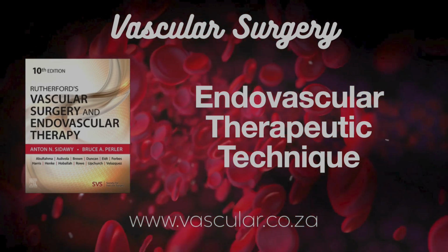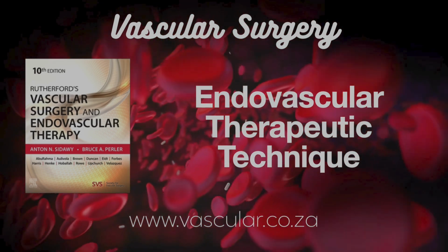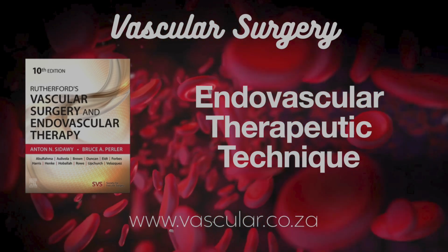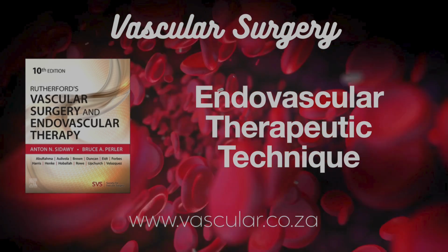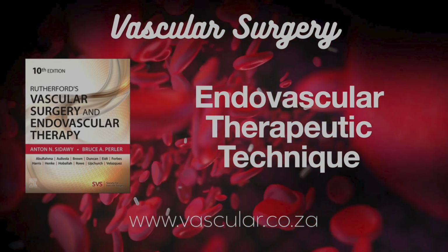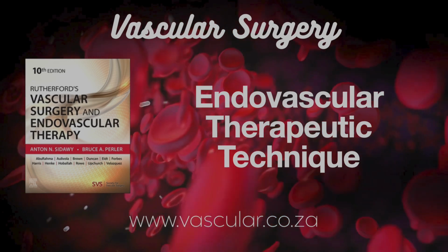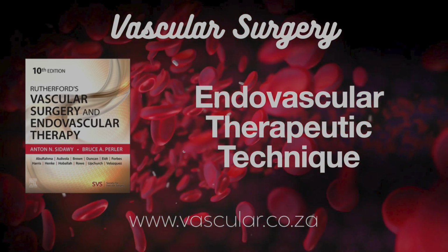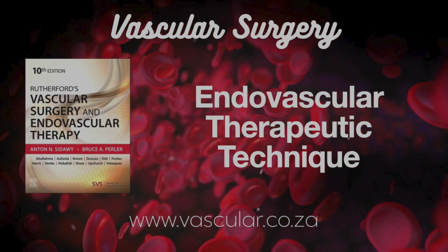Okay, let's unpack balloon expandable stents first. BES, key features. How do they work? The Palmaz stent was the first commercial one, widely studied. BES are basically slotted metal tubes crimped down onto an angioplasty balloon. So you inflate the balloon to deploy the stent. Exactly. Position the balloon, inflate it, the force expands the stent, embedding it into the vessel wall. Sometimes you see that doggy bone shape initially as the ends expand slightly faster before the whole thing opens up. The key is the permanent deformation of the metal providing immediate support.